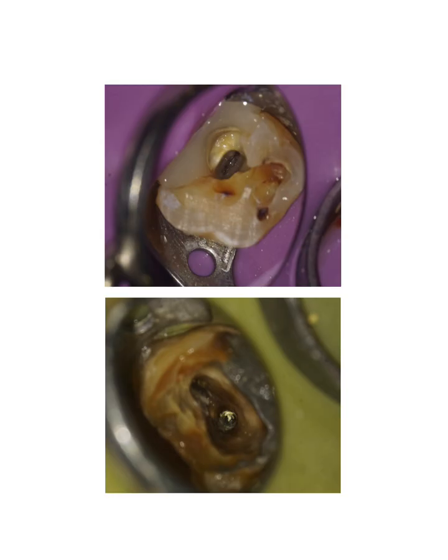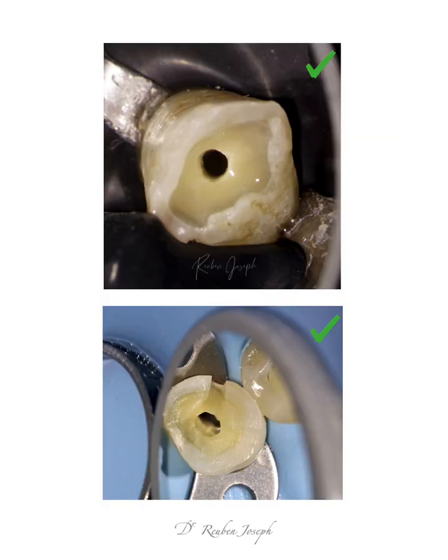My personal choice, or the only thing I would recommend if your purpose is to get good pictures or have a rubber dam sheet that doesn't sting your eyes too much when you're working, the only two colors are blue and black, light blue and black. They will give you the best amount of light and contrast for your images, and your images will look a lot better. I'm sure you will agree with me on this after looking at these two pictures.